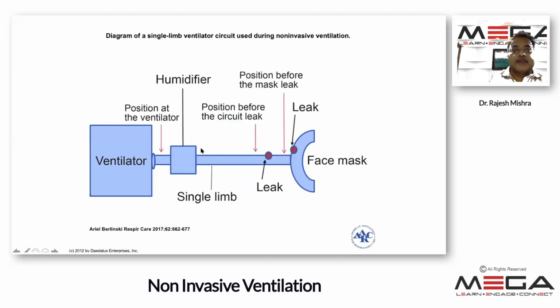Most important thing is that whenever we use non-invasive positive pressure ventilation, there's an excessive dryness of mucosa. Maybe it is being used for acute respiratory failure, maybe for night NIV for the COPD patient, or at-home BiPAP. Humidification remains a big challenge. But we have seen most of the time that the humidification valve is taken off and the patient is given oxygen or NIV support without humidification. And this causes a lot of problems.